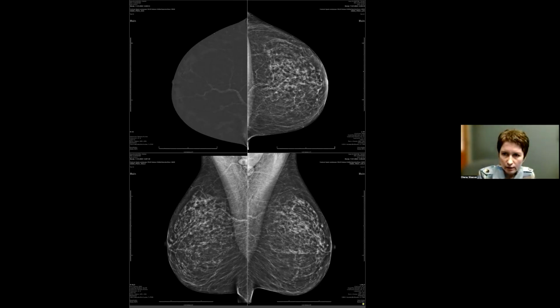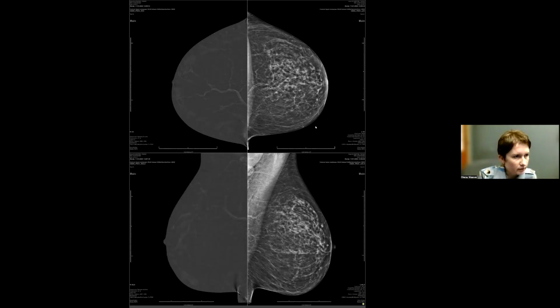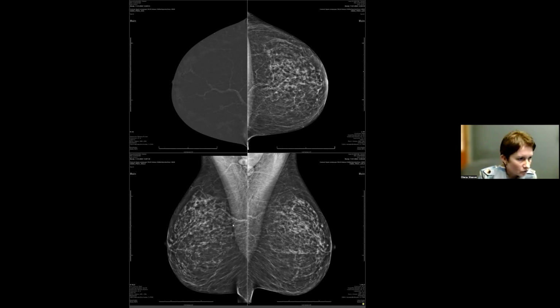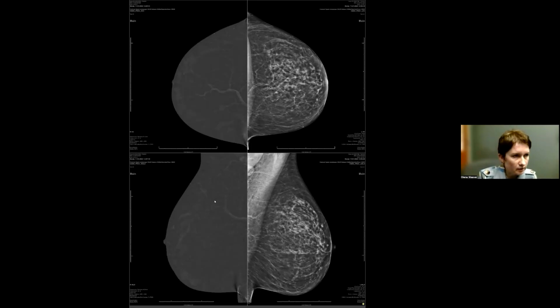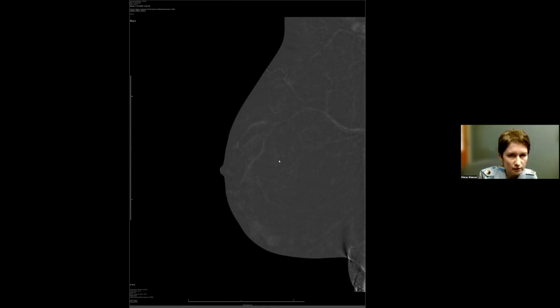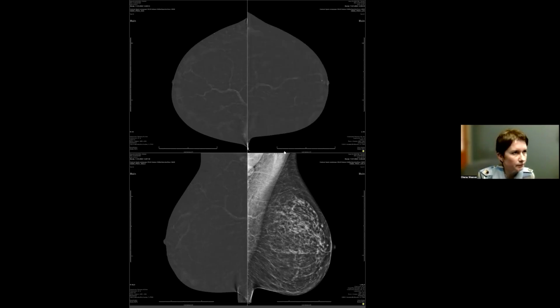Another thing is, if you notice those little tiny black dots, these are calcifications. That's how calcifications usually show up. At some point, it will be important when we will be talking about artifacts, because sometimes you see little white dots on recombined images, and those are usually not calcifications. So notice that the artifact that's created by the calcifications is little black dots. So this was a normal case of breast with scattered fibroglandular densities and minimal and symmetric background parenchymal enhancement.